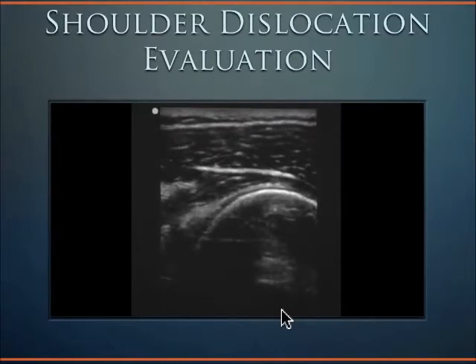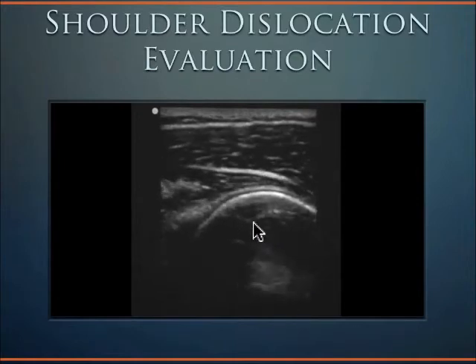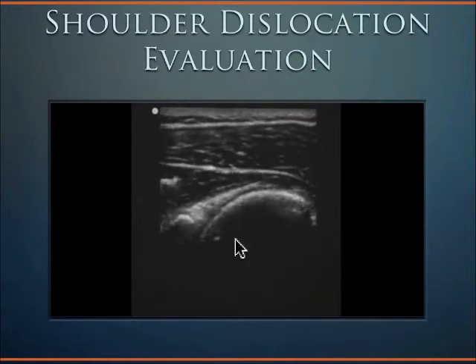You are looking for a nice, crisp humeral head, seen here, followed by an adjacent bright white structure that represents the glenoid rim, seen here.